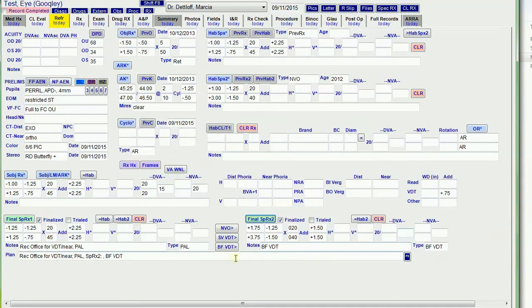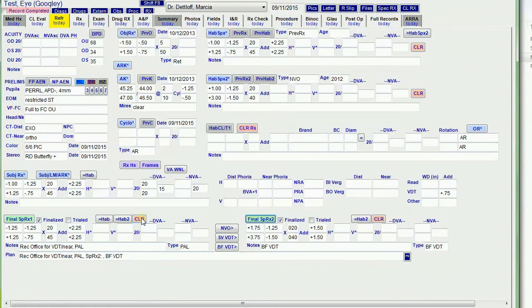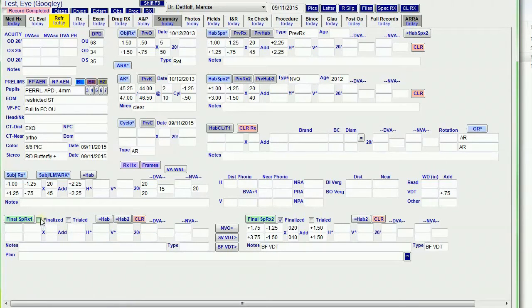And I close that. It appends Spectacle RX2 bifocal VDT to the plan. If I clear, it clears out this, it unchecks the box. It also clears out the RX1 from the RX tab.